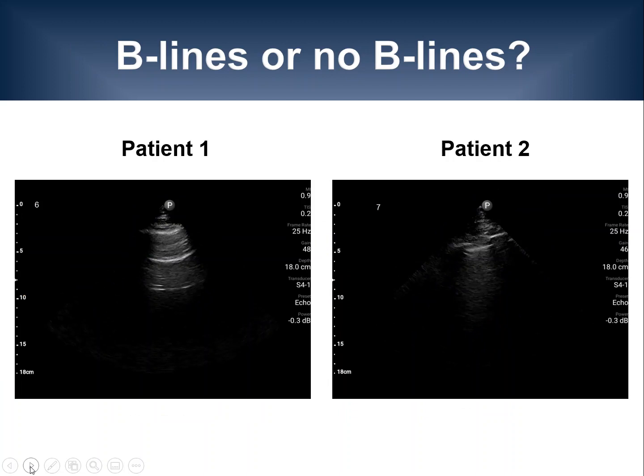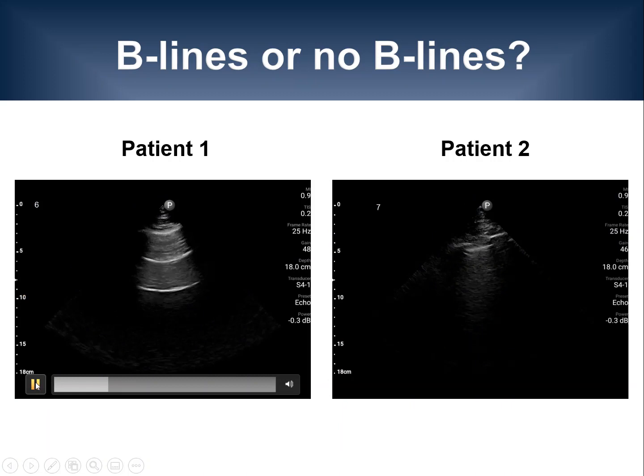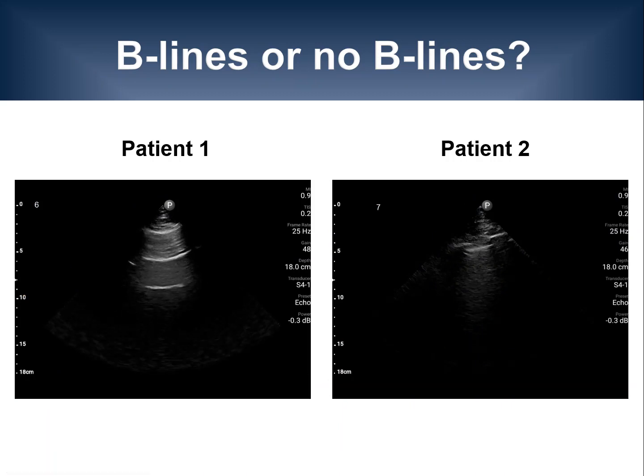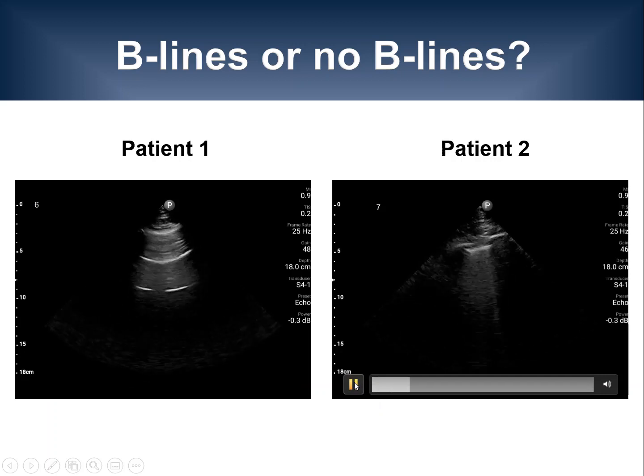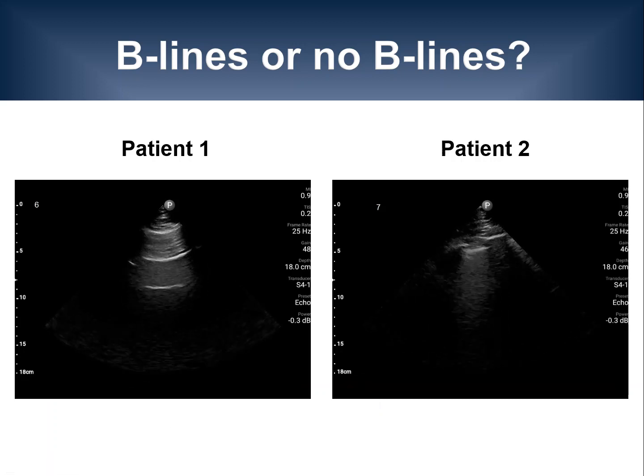As I mentioned earlier, lung ultrasound examinations can also be performed with pocket ultrasound devices. Here are two examples: patient 1 without any B-lines, and patient 2 who shows multiple B-lines.